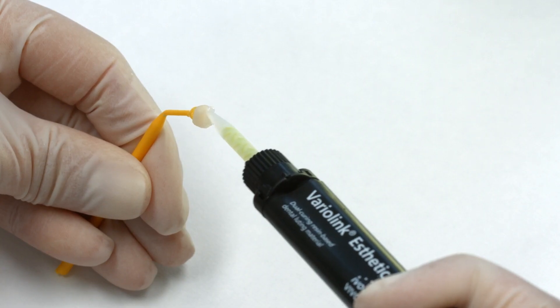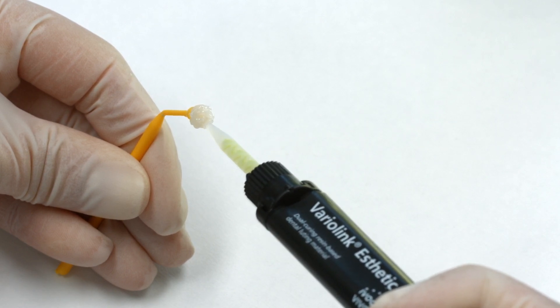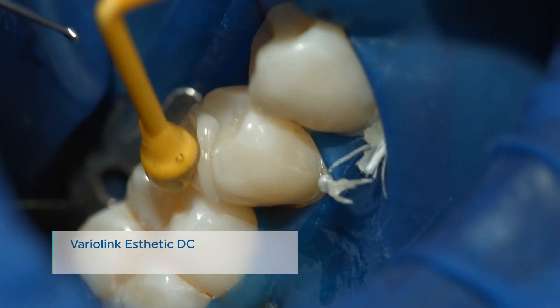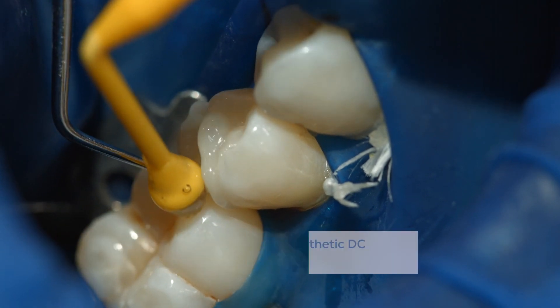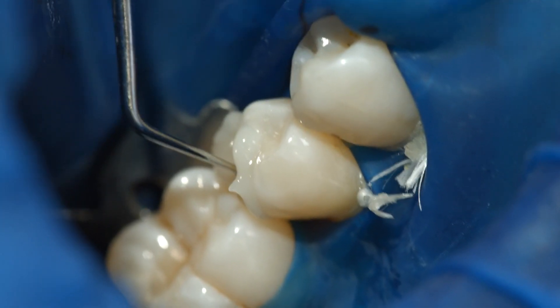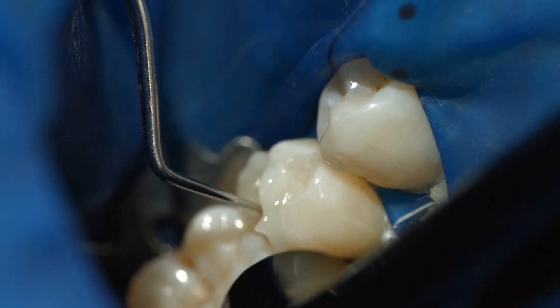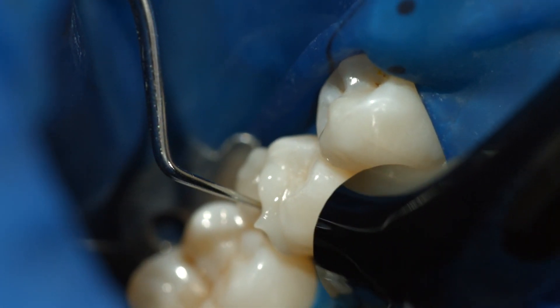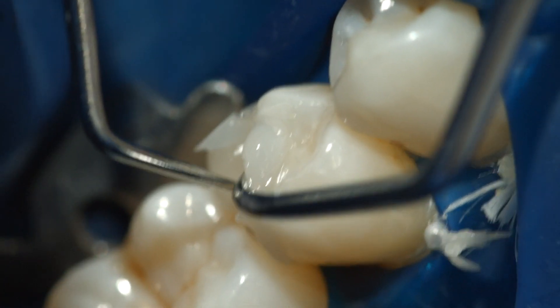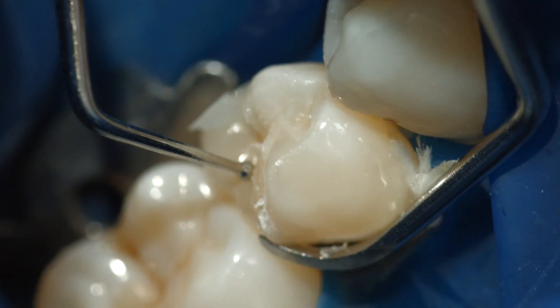Apply the desired amount of Variolink Aesthetic DC directly from the automix syringe onto the restoration. Seat the restoration and retain it in place exerting uniform pressure. Light cure cement excess for 2 seconds per quarter surface using blue phase style, for example. Make sure that the distance between the light probe and the restoration is 10 mm at maximum. The gel-like excess can be easily removed with a scaler. In proximal areas, use dental floss.